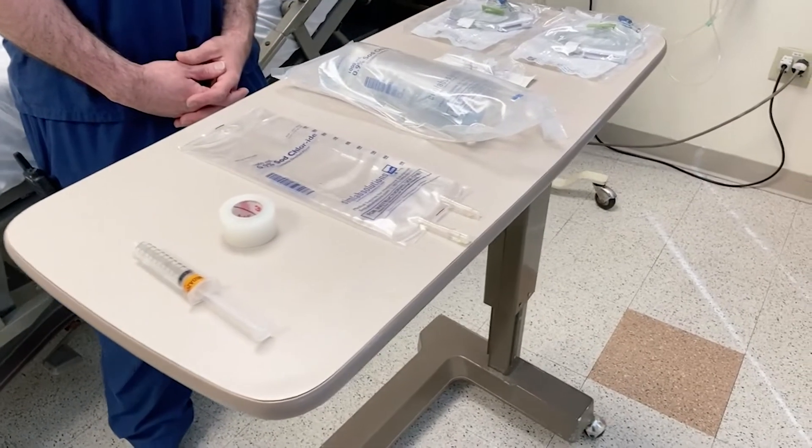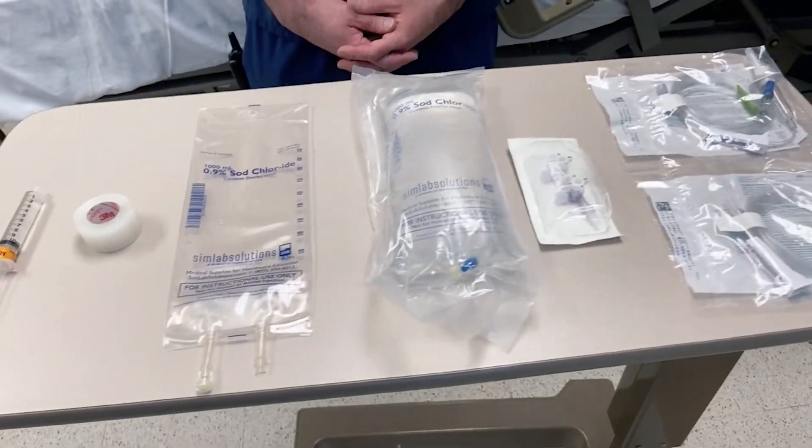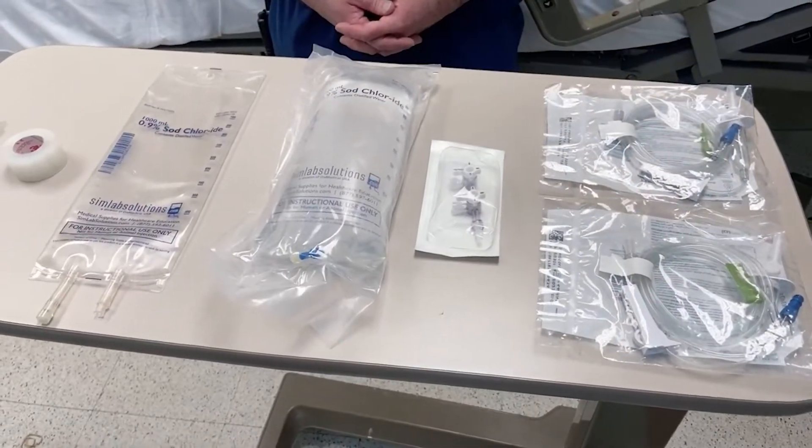Here's what you'll need. You'll need two IV bags — one empty and one full — two IV drip sets, a double stopcock, and some tape. And that's it.